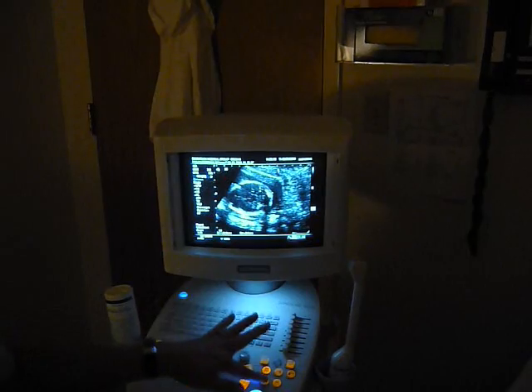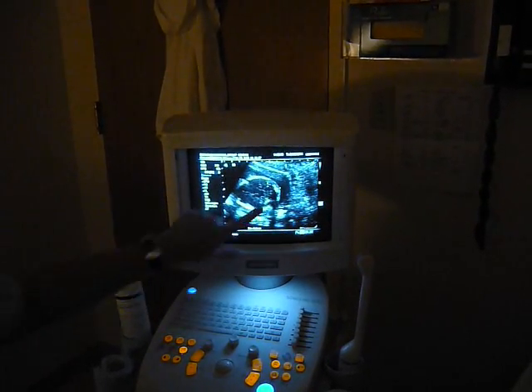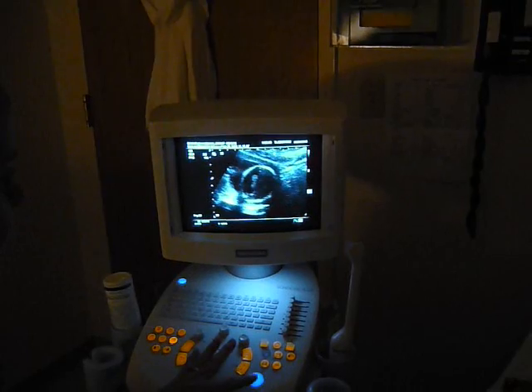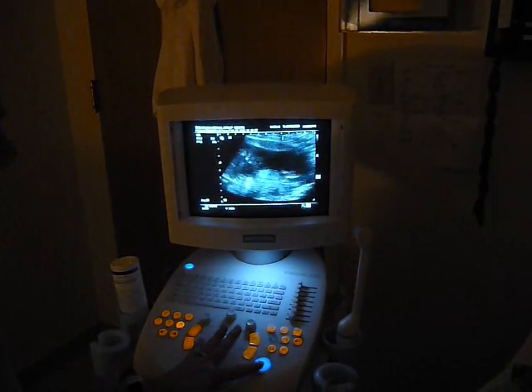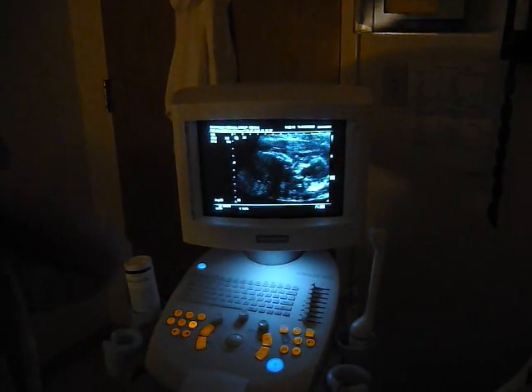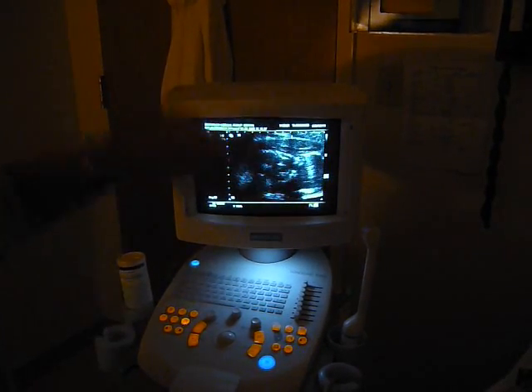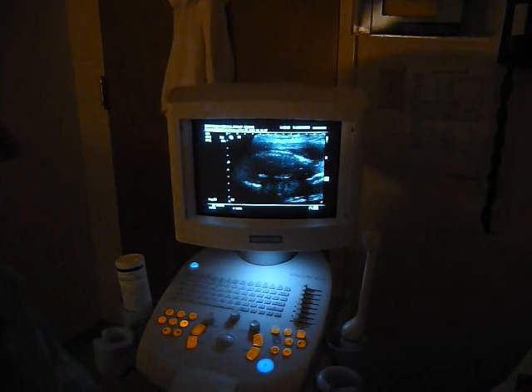So that's skin fold thickness. Anything under 5 is normal. Baby's is 3.4. Okay. And then cerebellum, part of the brain that can get misshapen if baby has spina bifida. That's good. And it's usually thicker if she does have spina bifida? If she has Down, the skin is thicker. And okay. If she has spina bifida, the cerebellum is like a nice little figure eight barbell shape, and it actually gets shaped like a banana, we call it, if it's being pulled on by a spina bifida.